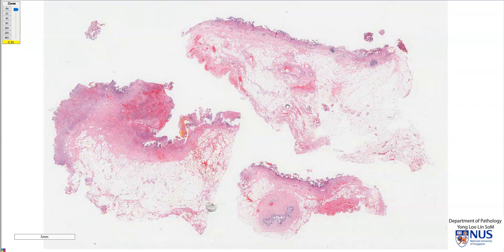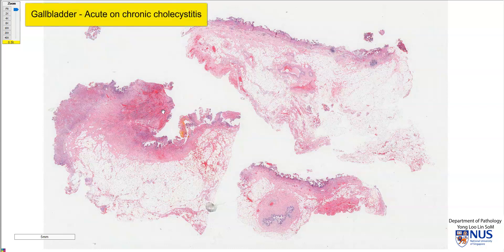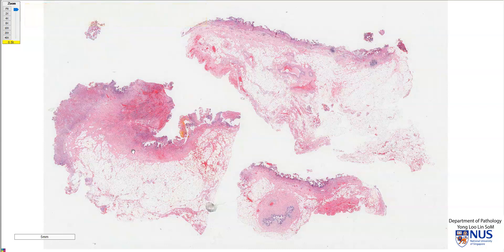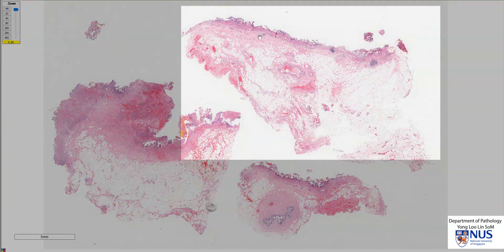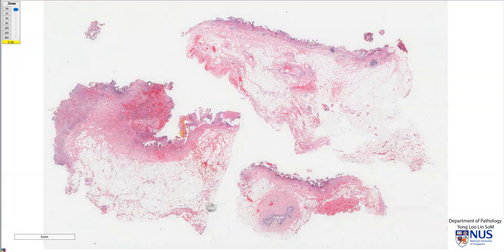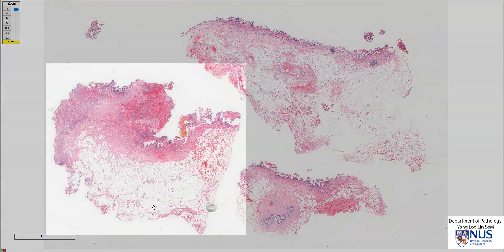This is a virtual microscopy slide taken from a case of acute on chronic cholecystitis. We're looking at three pieces of the gallbladder wall, and I'm first going to focus on this piece here, and then subsequently we will move our attention to this piece, which shows most of the features of acute cholecystitis.